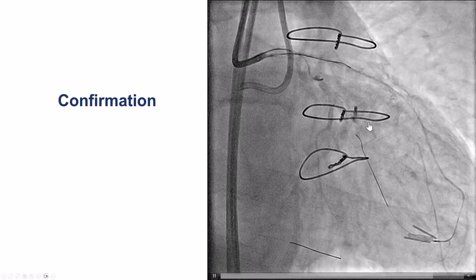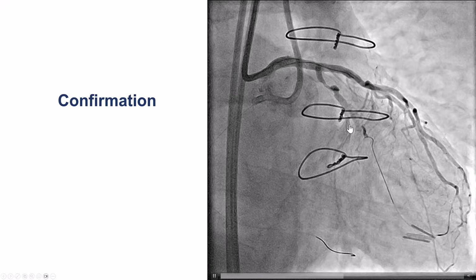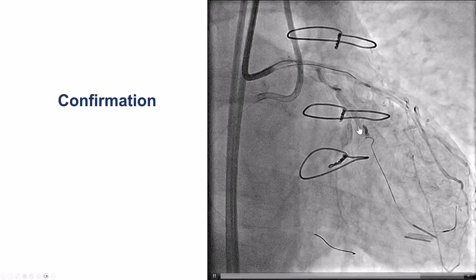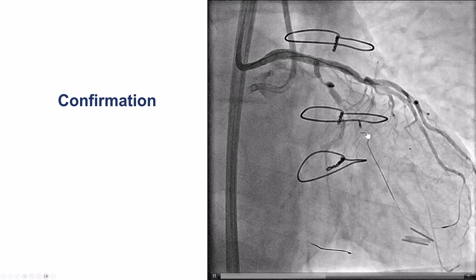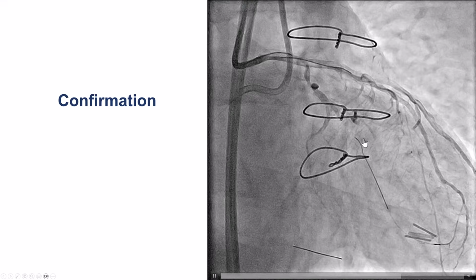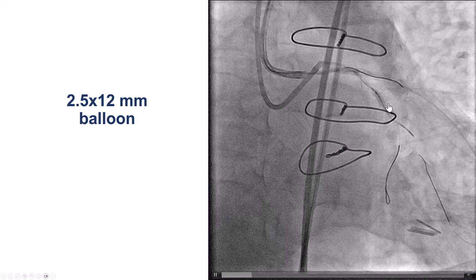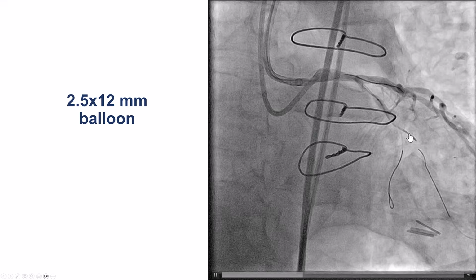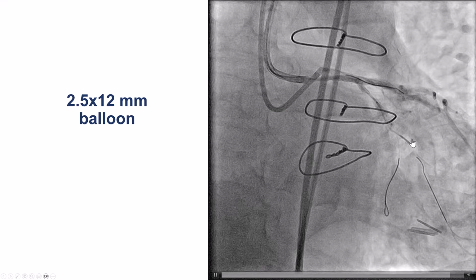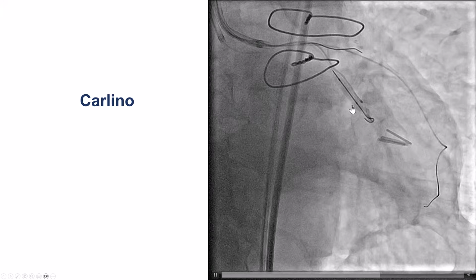However, we do see this staining at the proximal cap, and it's hard to know what this is, but most likely we created a little rupture of that little bridge that we're trying to knuckle wires through. The patient was having some chest comfort at this point, so we inflated a 2.5 balloon. We confirmed that there was no flow going forward. We do have a microcatheter under this balloon, and then we try to see how we can overcome this.